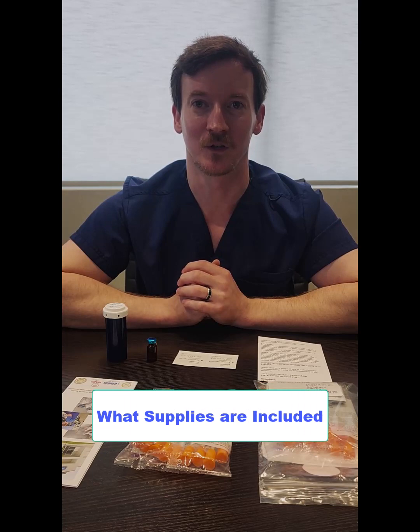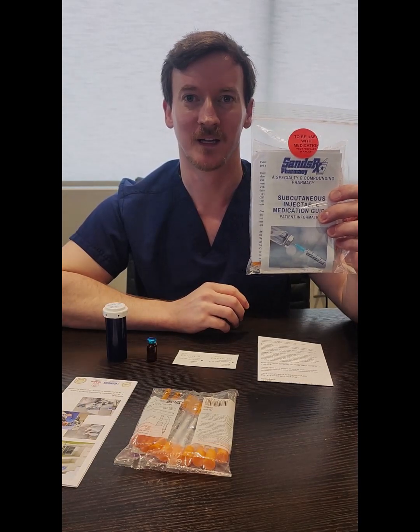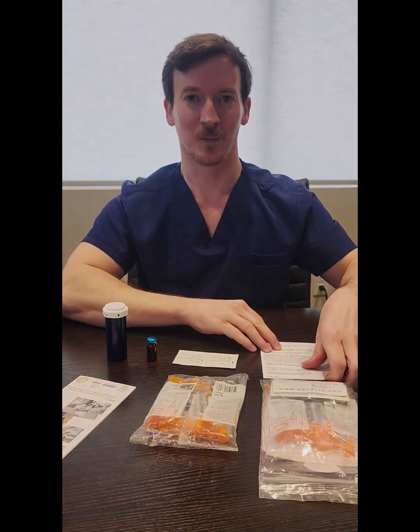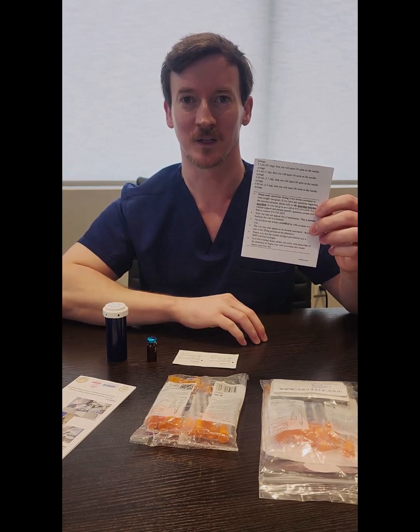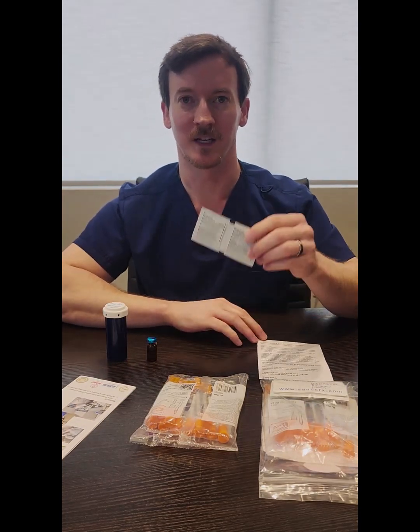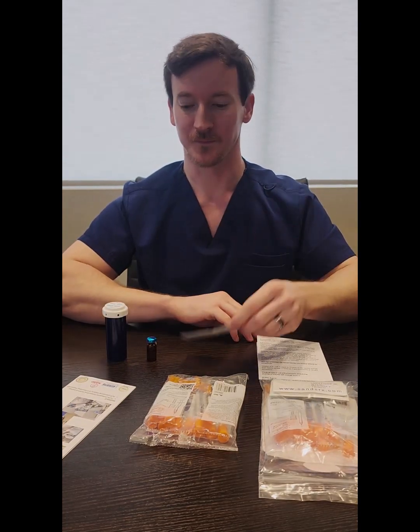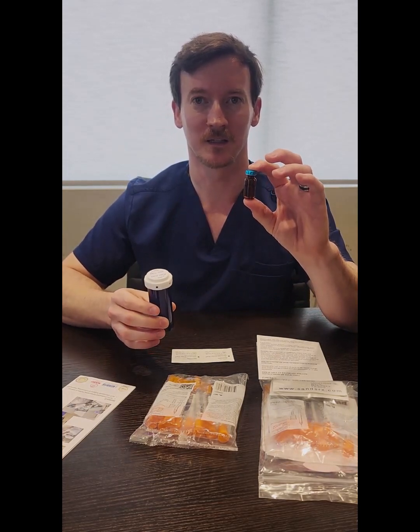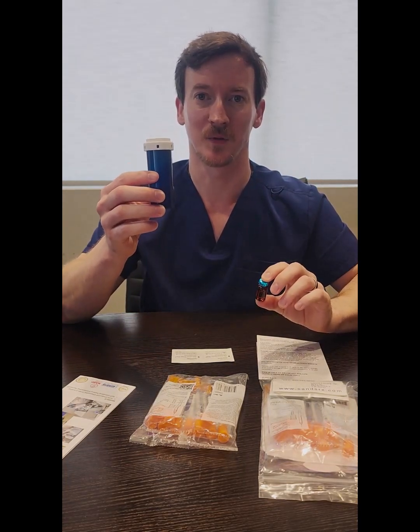Before we get to the injection, I want to go over the supplies that are going to come with your medication. With the medication, you will get a pack of supplies that looks like this. Inside, you will have a 10-pack of insulin syringes, a tri-fold that also talks about how to do a subcutaneous injection, a patient education sheet about the medication, a 10-pack of alcohol swabs, and your medication. Your medication will have a foil seal on the top, it will come in a vial like this, and this will be inside of a plastic pill bottle.